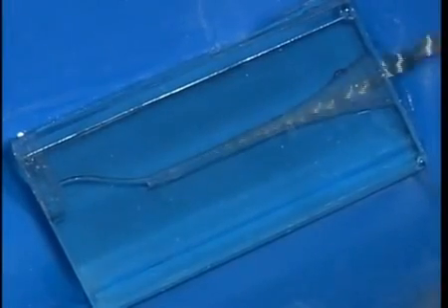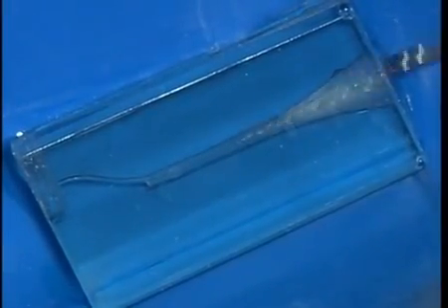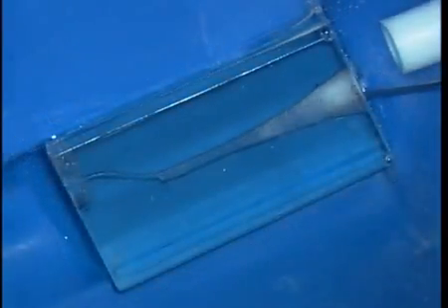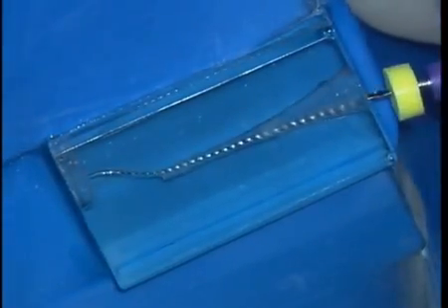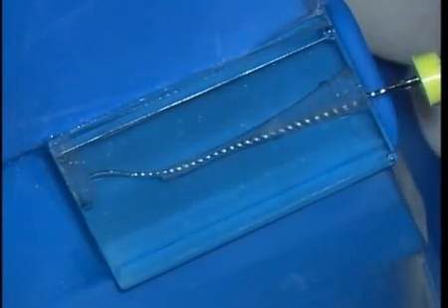Rotary instruments are used to pre-flare and further expand a shaping wave in the coronal 2/3 of the canal. This is the Shaper 1. After it's used, notice the debris needs to be flushed out of the tooth, and again we recapitulate with a small file to make sure we still have that glide path. Let's focus on ledge management.